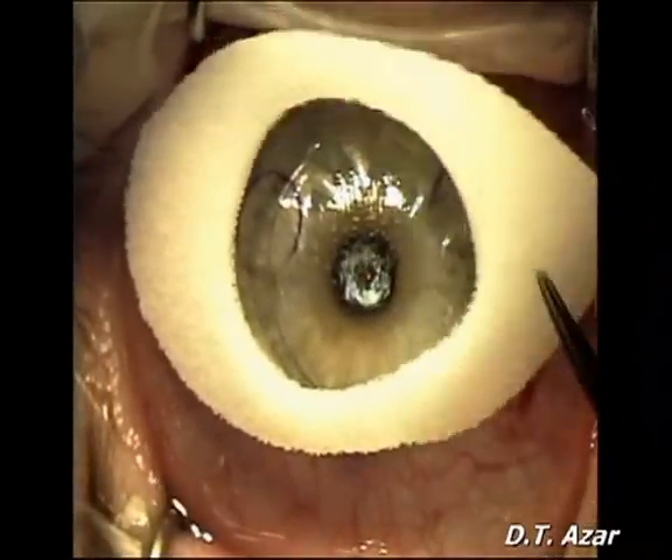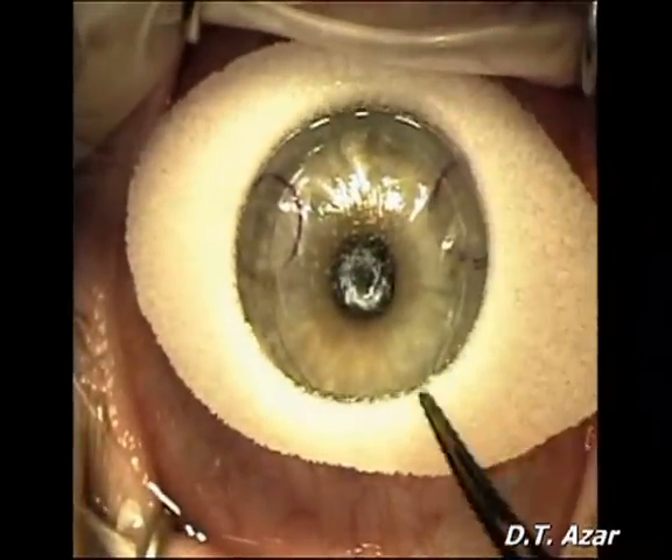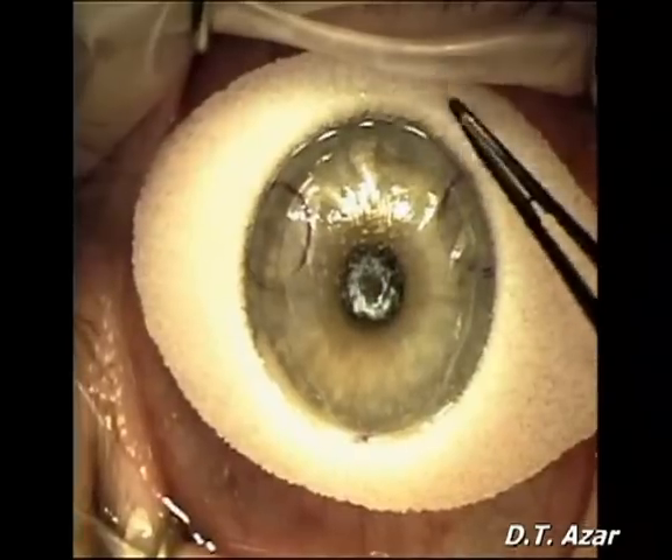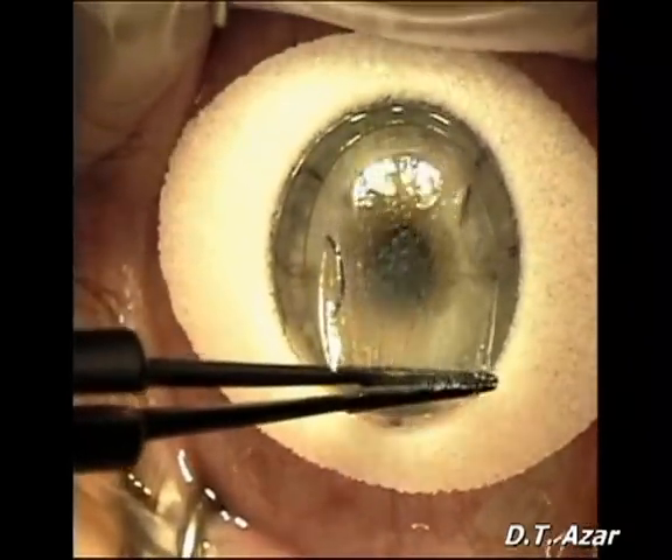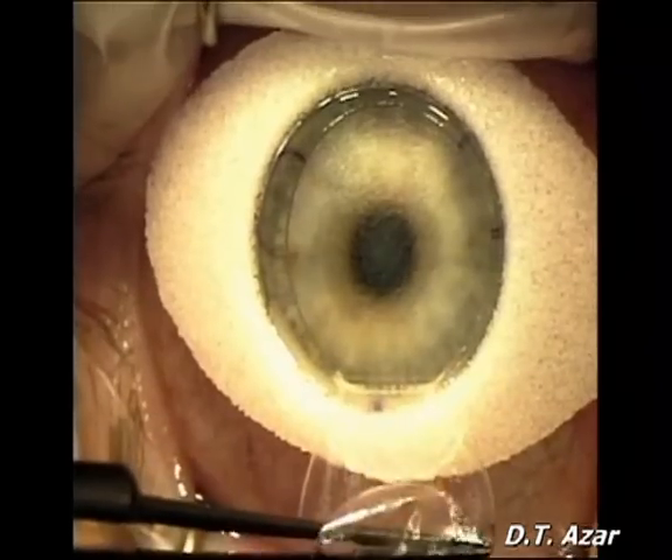A cellulose sponge is placed over the conjunctiva to avoid contact between the flap and surface fluids. A forceps is used to gently reflect back the superiorly hinged flap.